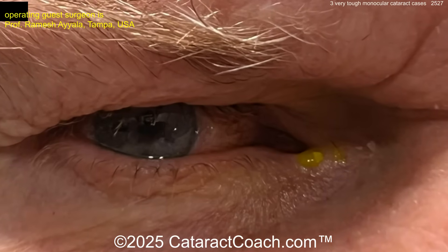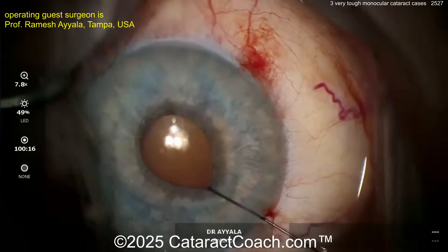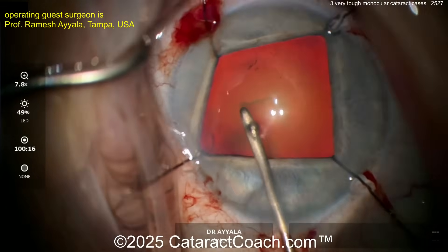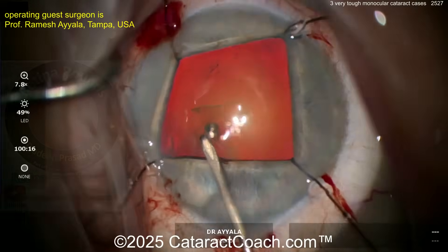Look at just the axis — it's going to be so difficult. Now here comes some iris hooks being placed. We have Professor Ramesh Ayala from the University of South Florida in Tampa as our guest surgeon here, a true master surgeon who's going to teach us the way.